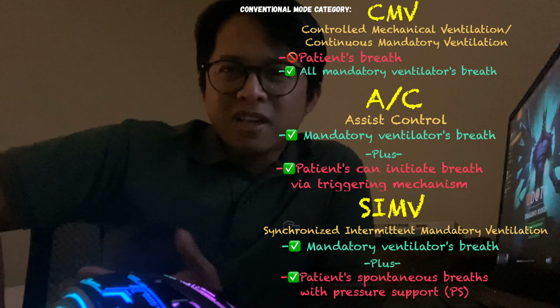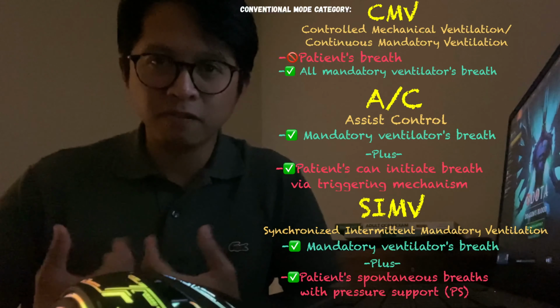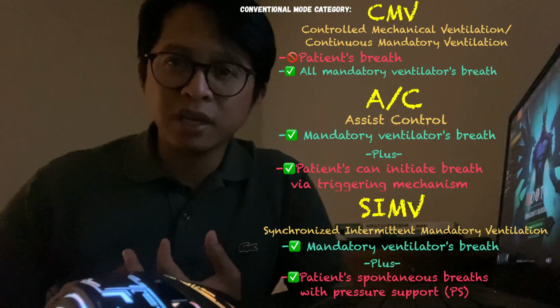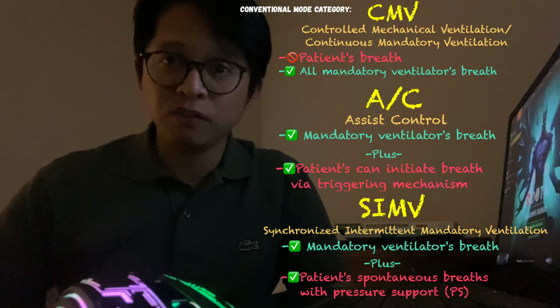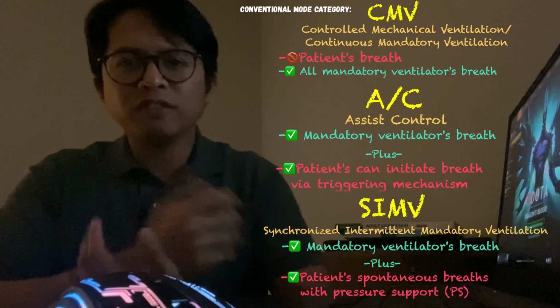Okay, let me ask you something. When you have a patient, for example, on SIMV mode with an RR of 12, tidal volume of 500, minimal FiO2, and hemodynamically stable, but on fentanyl and Nimbex infusion. So Nimbex is cisatracurium, a muscle relaxant. What mode of ventilation is he on?